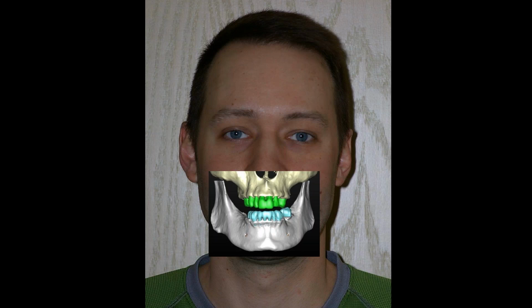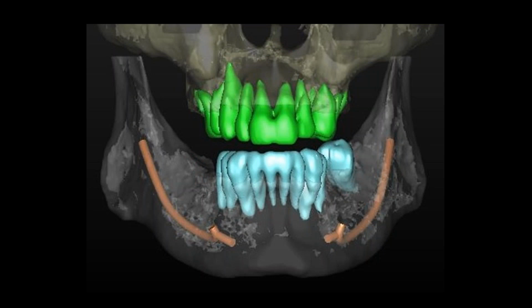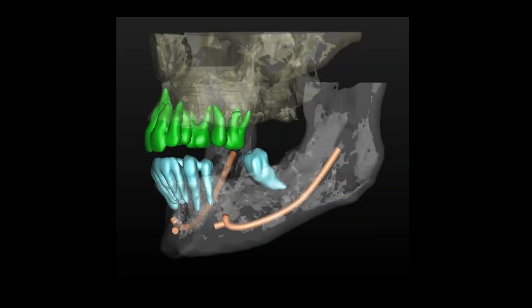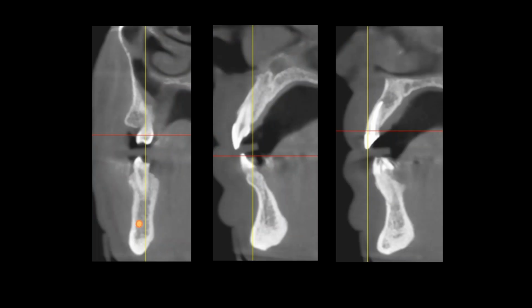We went ahead and did a full scan, and using the software through 3DDX, we actually got a custom conversion to clean up any scatter that there may be, to identify the areas to see if in fact this patient had enough bone for implant therapy, and to see if these teeth should be restored or should they be extracted. So clearly we could identify the landmarks, whether they were the sinus cavities or the mandibular nerve. We could also see if there were any undercuts of any sort.